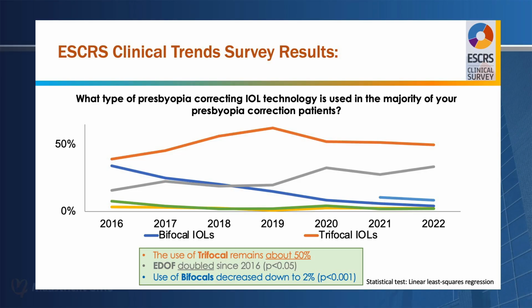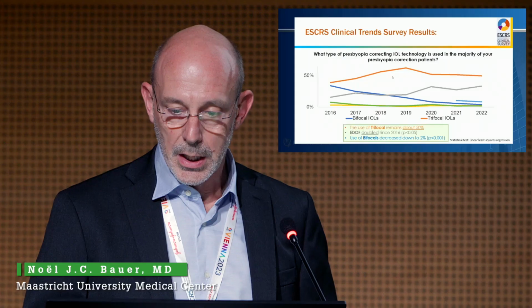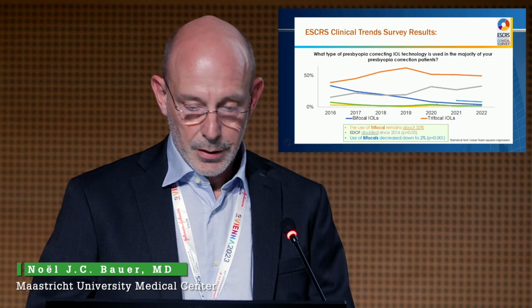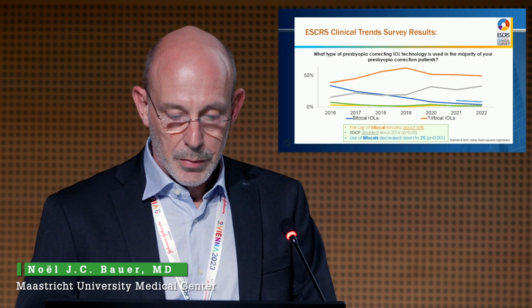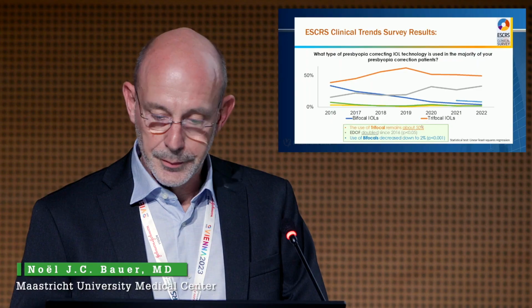This is a clinical survey that has been done by the ESCRS asking what type of presbyopia correcting IOL technology do you use most of the time in your patients. And you see that this is more or less rather stable over the last 6 years, with the use of trifocals remaining about 50%, but EDOF lenses doubled since 2016.